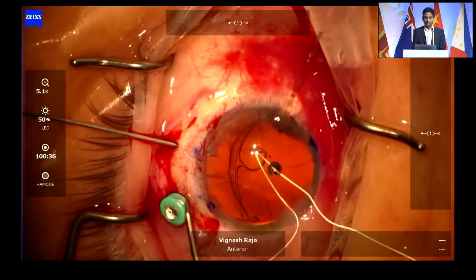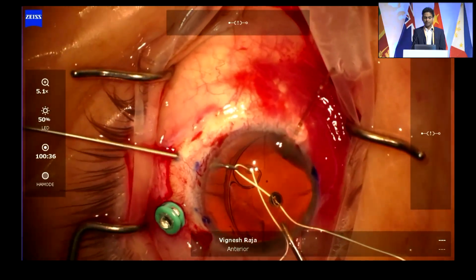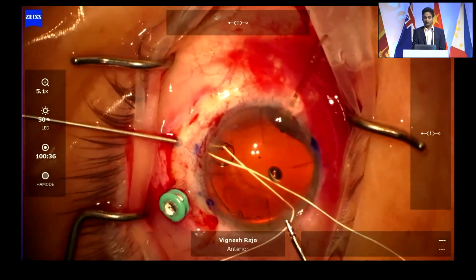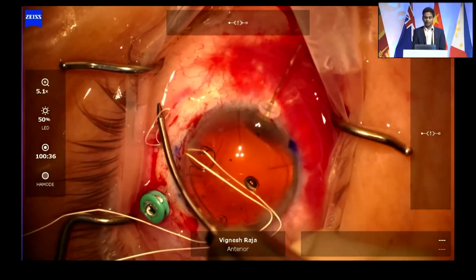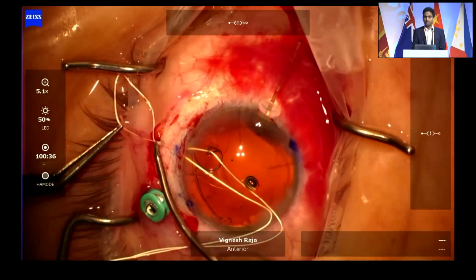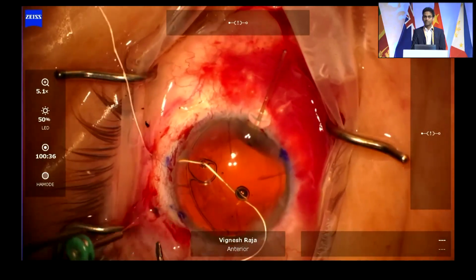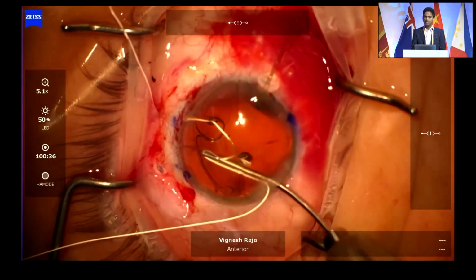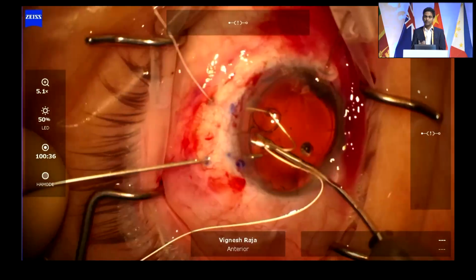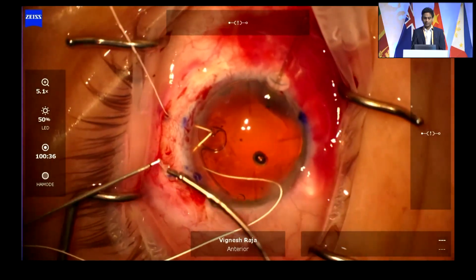So what I then do is I take out the sclerotomies, and using a max grip forceps, I just pull one end of the suture. And you can pull any end. You don't have to go either or. Once you pull one end, then you can always pull the other end, and it threads it around the eyelet of the haptic. So the advantage of this technique is you're not railroading blindly with any suture, and it's all very controlled. You're using max grip forceps and externalizing this.